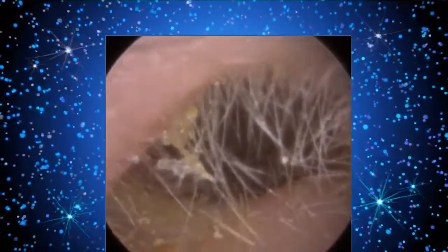Onto the left ear now, you can see quite a few cilia at the entrance. There is quite a lot of dry earwax here as well, but it's not as occluding, I would say, as the original right ear. In the right ear, some of the dry wax is really lodged medially against the eardrum, whereas this is more lateral, so near the entrance and mid-canal. Slowly but surely, we're just wriggling out this dry wax.